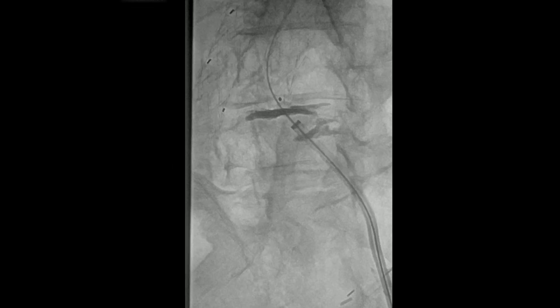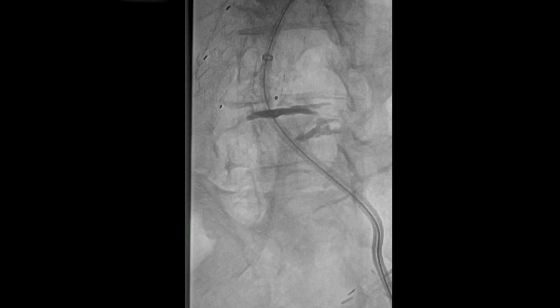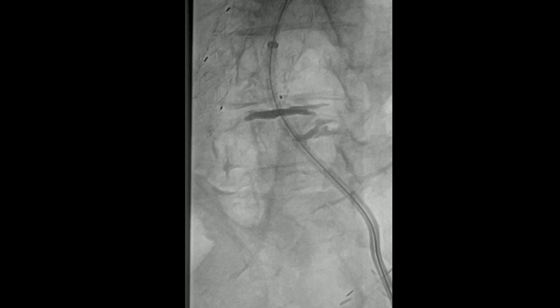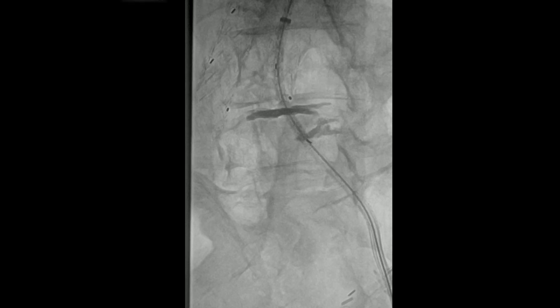So then you're going to take it back out and put the dilator back on the sheath. Even here, you can see you probably need a little bit more stiff wire up there — it looks like that had come back a little bit. Readvance the wire. Now the sheath is up inside the left iliac limb.